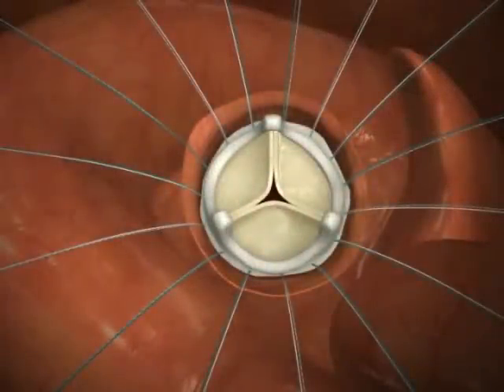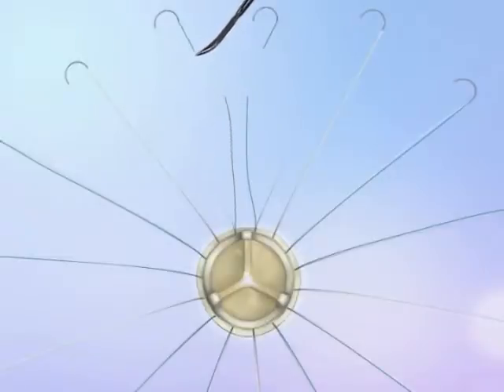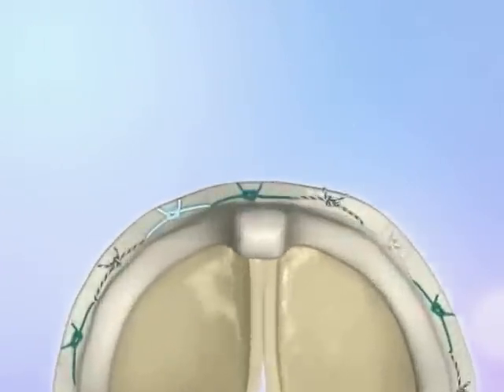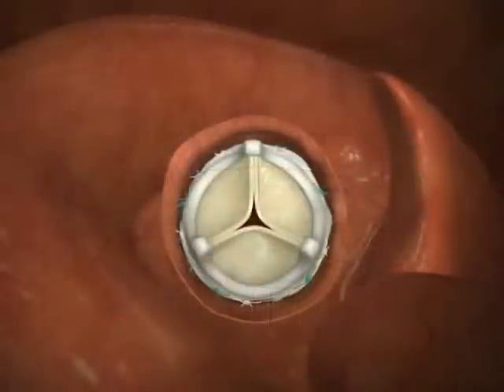Properly seat the valve in the valve annulus. Cut off the needles from the suture and tie light colors together: white to adjacent white, green to adjacent green, and co-braid to adjacent co-braid.